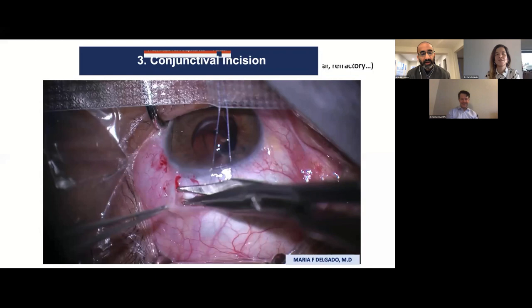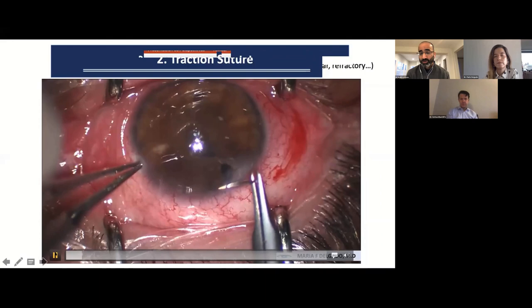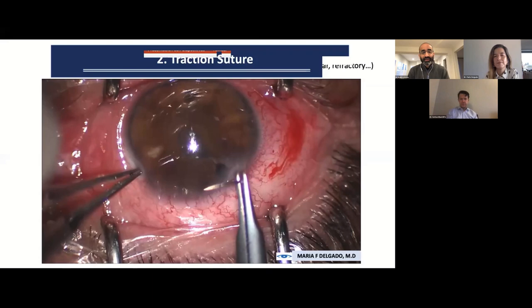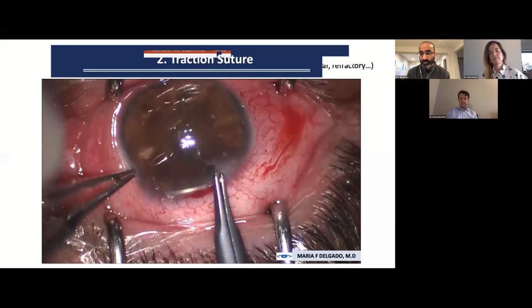Okay, the previous video makes me think of when you're first training a resident or a fellow, and they pierce, they go through the entire cornea. There's this freak out moment where it's like, oh my God, I just went into the anterior chamber. What do I do? And my thing for that is just keep going. Get the bridle suture in and just create a paracentesis, put some viscoelastic in, and the patients tend to do very well. You don't have to think about suturing or doing anything.